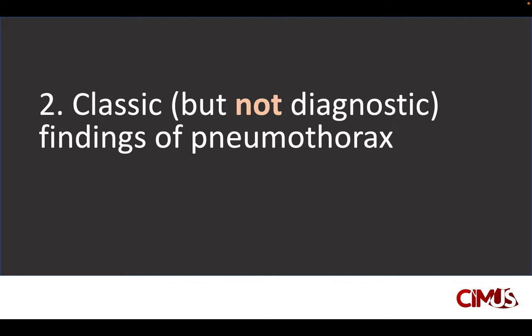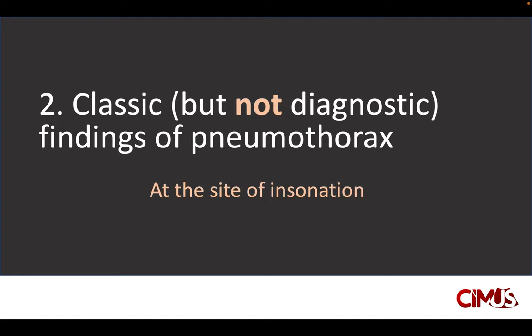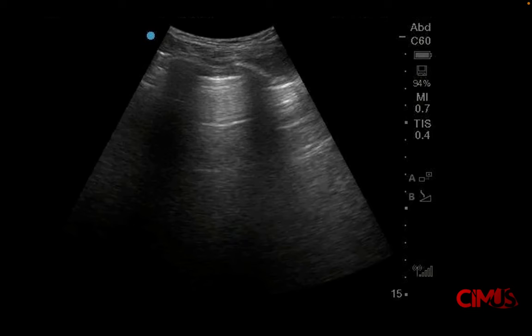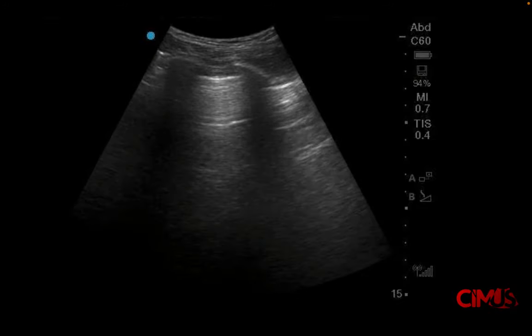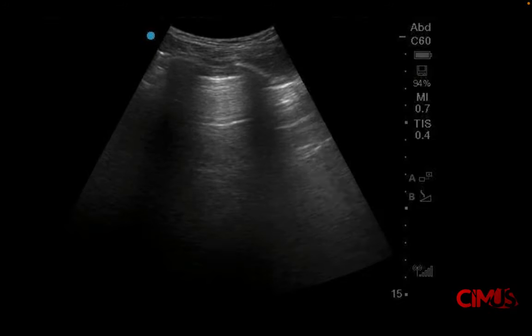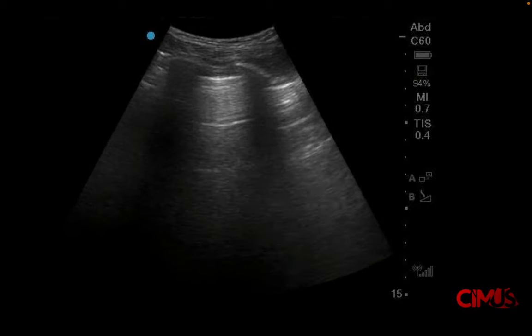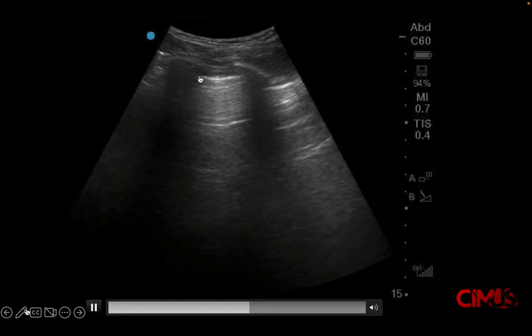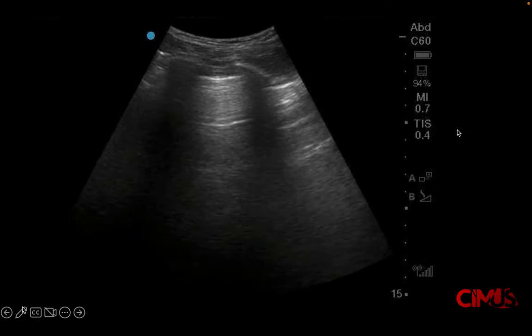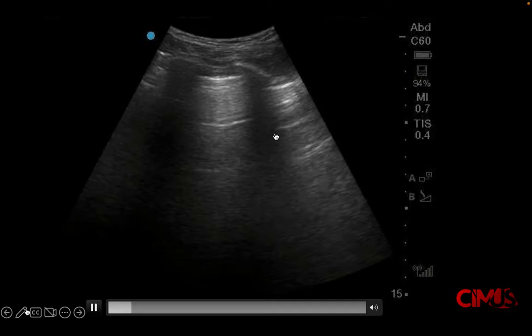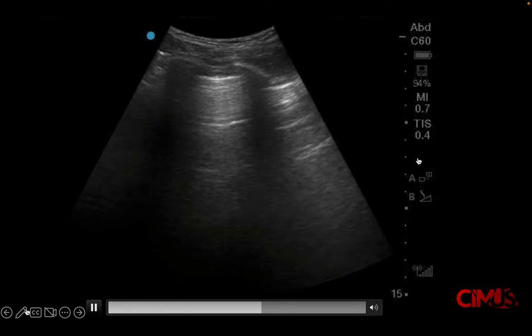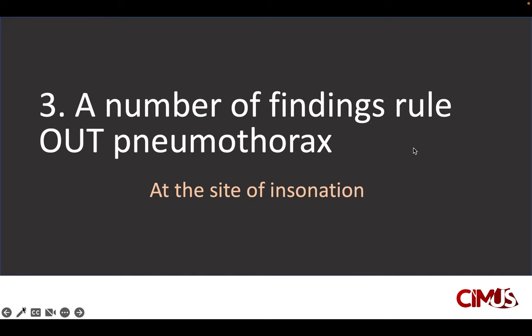Principle two: what are some classic findings of pneumothorax? These are classic but not considered diagnostic, and apply only at the site of insonation. Here's a classic presentation: you see no evidence of lung sliding at the pleural line, and there is presence of A-lines. These findings are typical but not definitively diagnostic of pneumothorax.